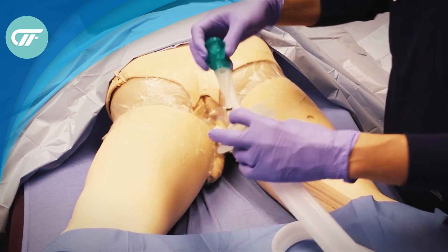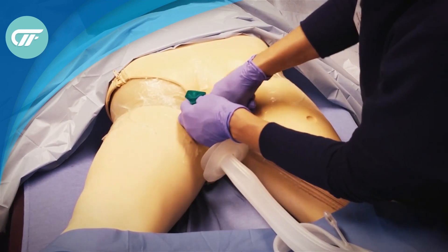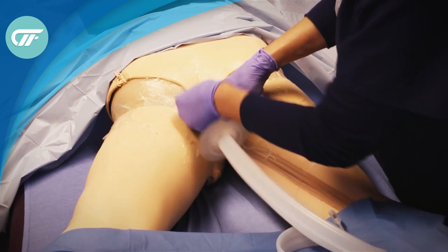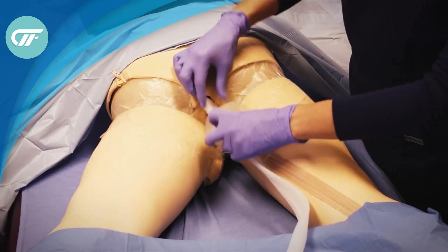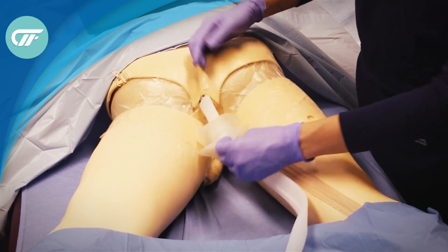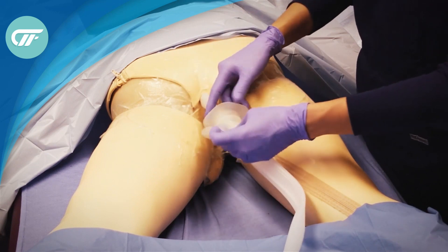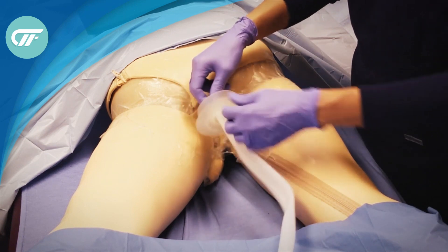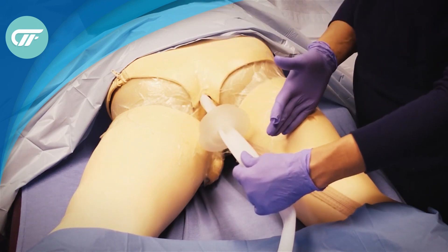Then you place the fecal management system into the patient. Once the fecal management system has been placed to the black line as per factory recommendations, the fistula funnel is around the fecal management system. This is the technique for placement.